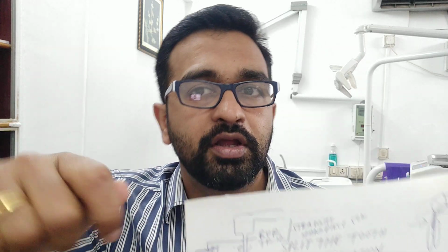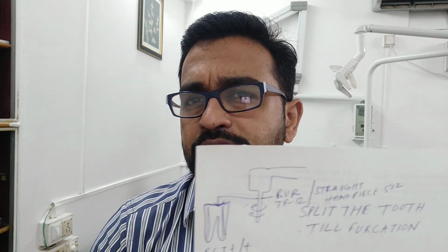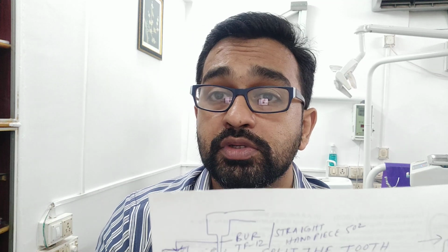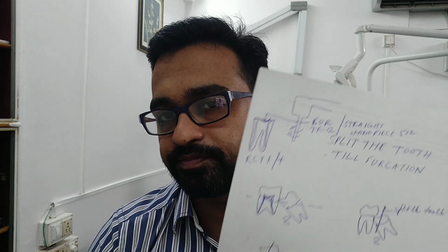But if you are using a Coupland on the root canal treated tooth, then when you give the force, the tooth will break. So in those cases, you can use the Coupland very deep, or if your Coupland is not going deeper, or if the area is inaccessible, you can use a Warwick James curved elevator. ठीक है, curved Warwick James. It's like a hook type of elevator.